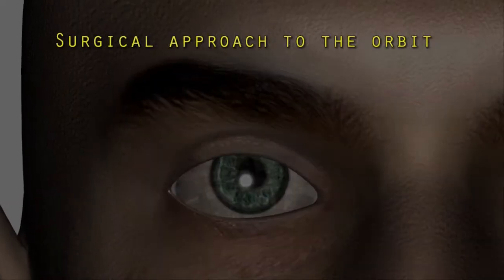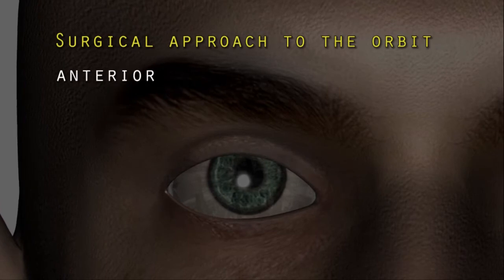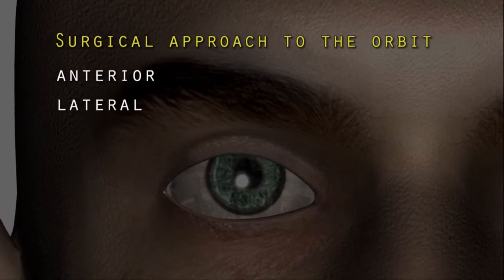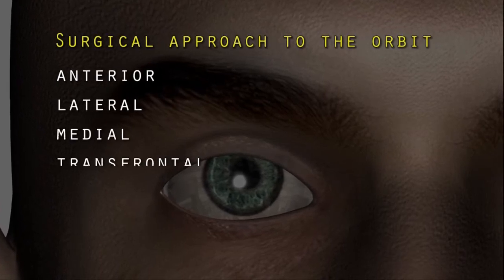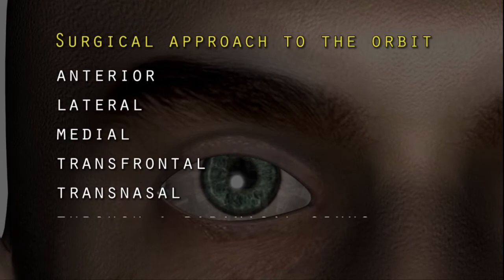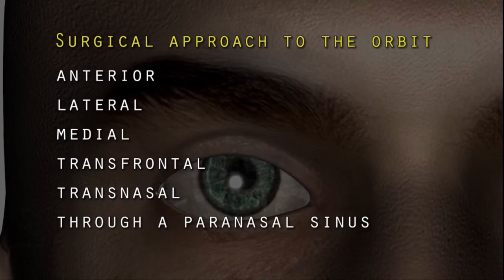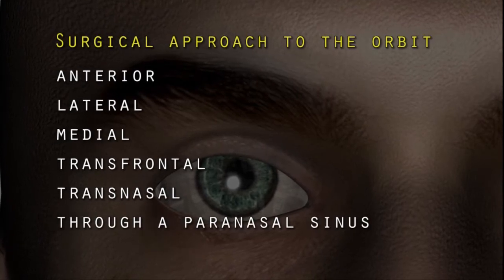Surgical approach to the orbit can be anterior, lateral, medial, transfrontal, transnasal, or through a paranasal sinus.